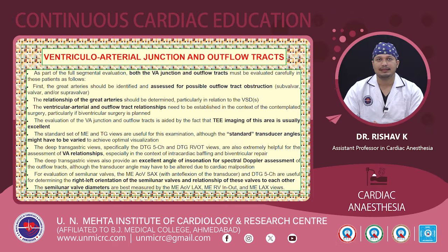Also, the evaluation is aided by the fact that the TE imaging of this area is usually excellent, and one thing that we need to keep in mind is that the standard transducer angles may need to be varied to achieve the optimal visualization.